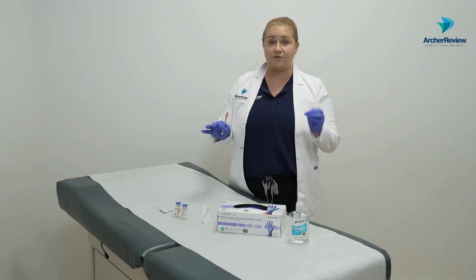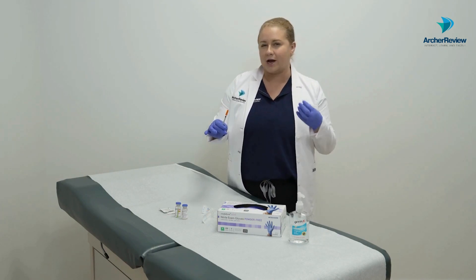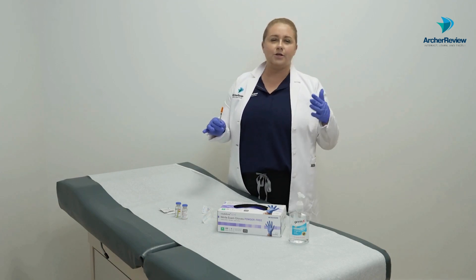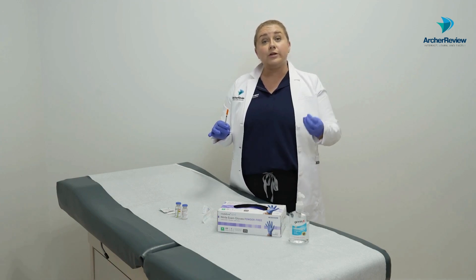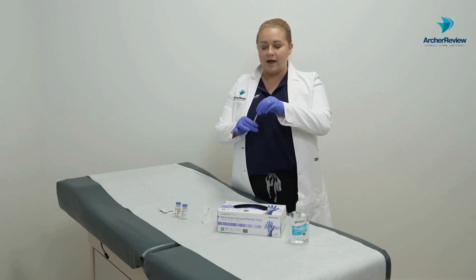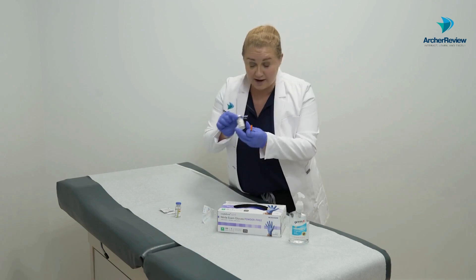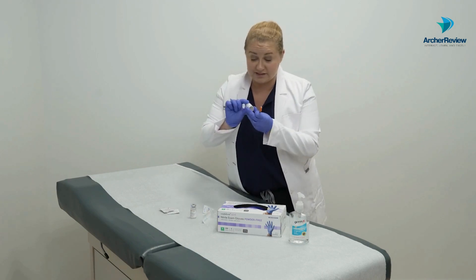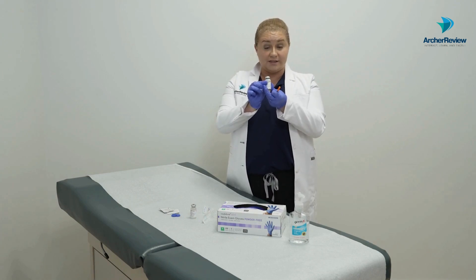We need to go in a specific order. When we draw the medicine up, we go regular first and then NPH. I remember that because it's RN — just like registered nurse: Regular, then NPH. But because we want to draw up the regular first, we have to inject the air into the NPH first. So I'm going to go ahead and get my NPH insulin out.